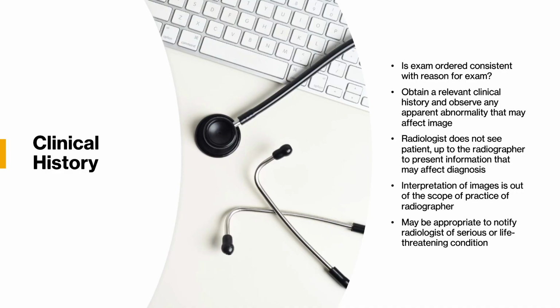If you see something on the imaging, however, that is serious or life-threatening, then that's an immediate phone call. If you're working nearby the radiologist, then you can stop by their office, but if you're in a separate area of a hospital or something along those lines, it's important to notify them as soon as possible that there is something serious or life-threatening that may be on that image. Not the patient, though, because again, that is outside of your scope of practice, but this will prioritize that imaging so that the radiologist can look at it faster.